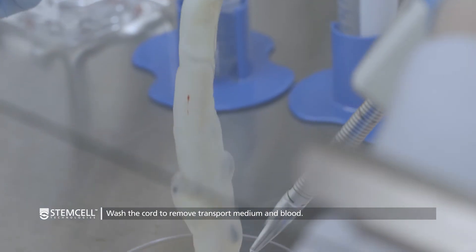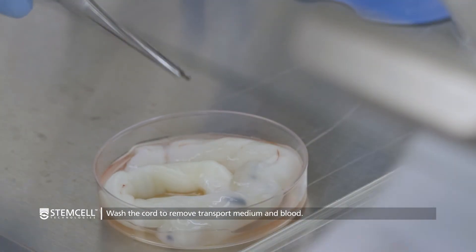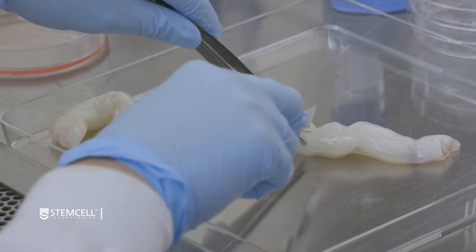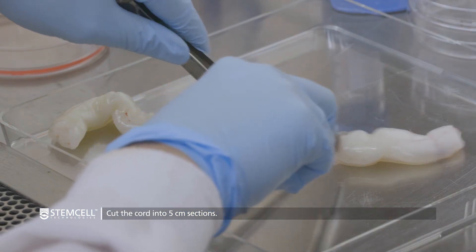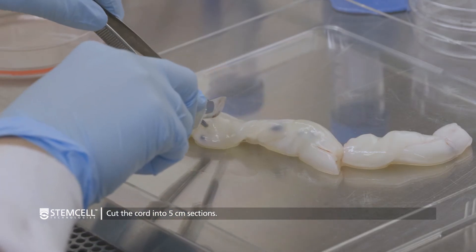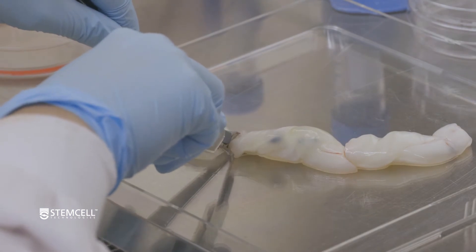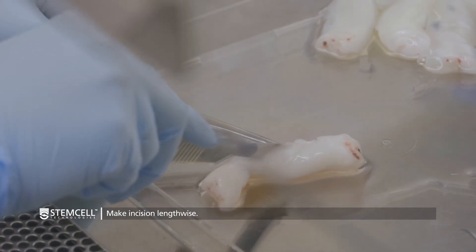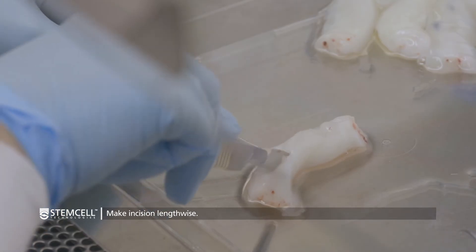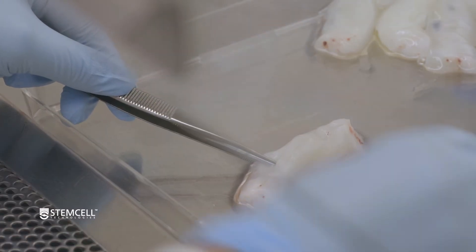Wash the cord with PBS to remove transport medium and blood. Cut the cord into roughly 5-centimeter sections using the scalpel to make it easier to handle. Make a shallow incision lengthwise in one 5-centimeter section, being careful not to cut into the vessels.